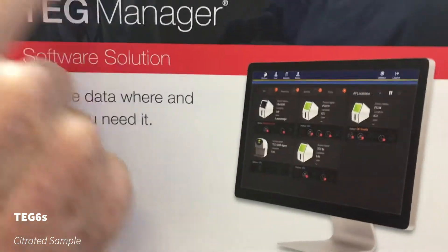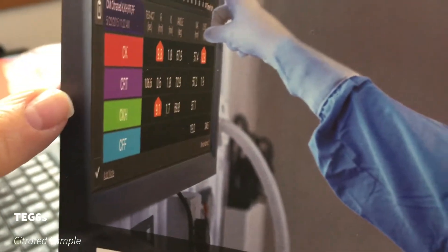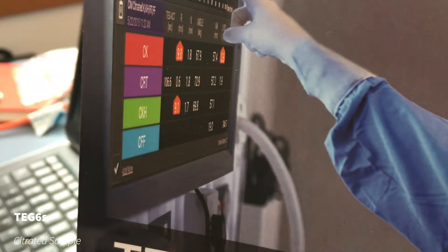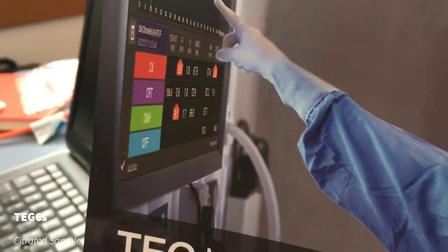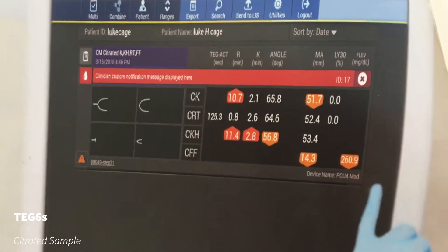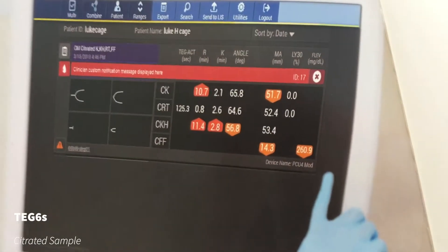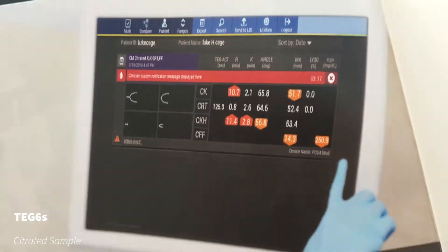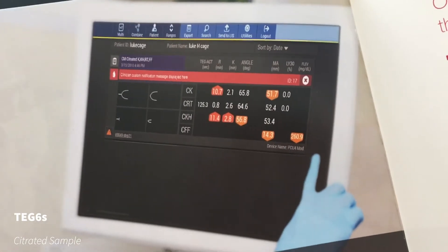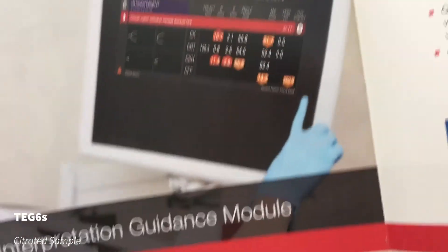That's what you would see on the theater screen — color-coded channels for each parameter. CK and CKH are looking at the clotting time, and CFF is looking at clot strength related to platelets and fibrinogen, so we tend to match those two channels. Coming to the interpretation guidance: if the TEG results are out of range, it will give you a message on TEG Manager — not on the device itself, only on TEG Manager — and that will tell the doctor a recommendation from the algorithm. Finally, the online e-learning systems have three free courses provided by Haemonetics that anyone can do to learn how to interpret and operate the device.